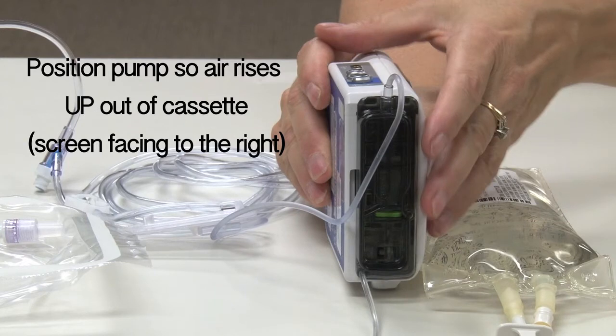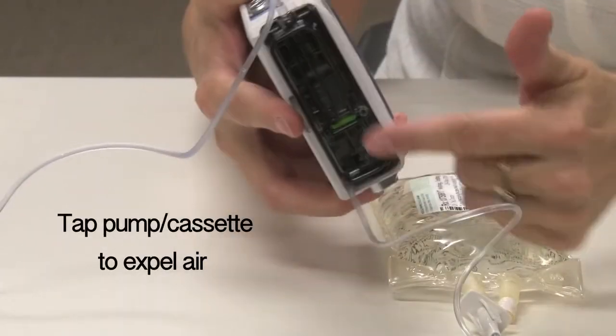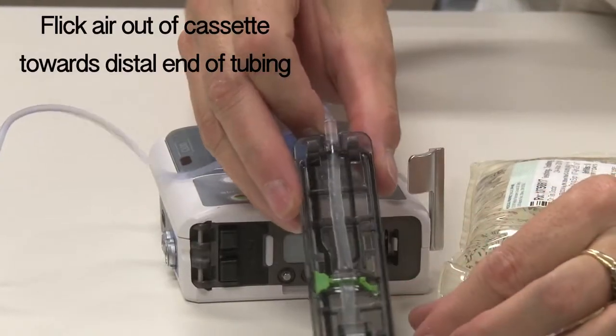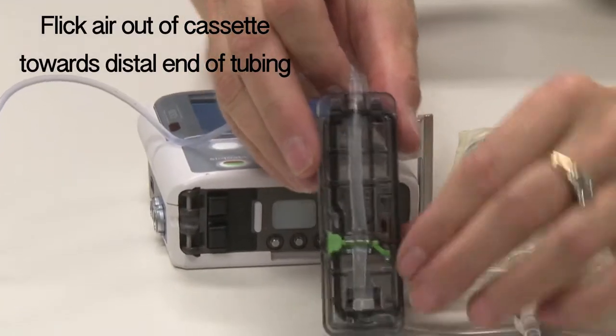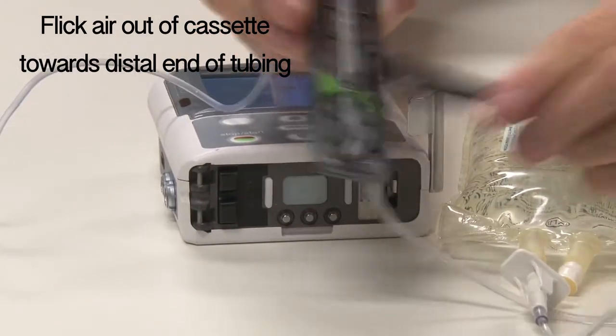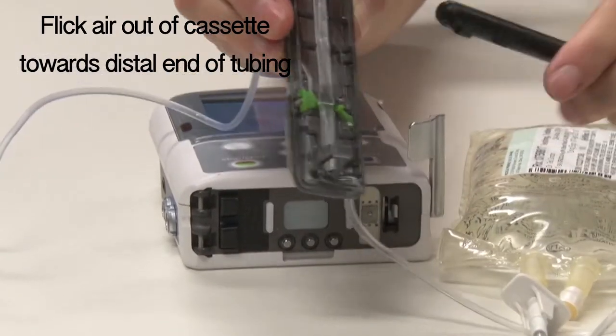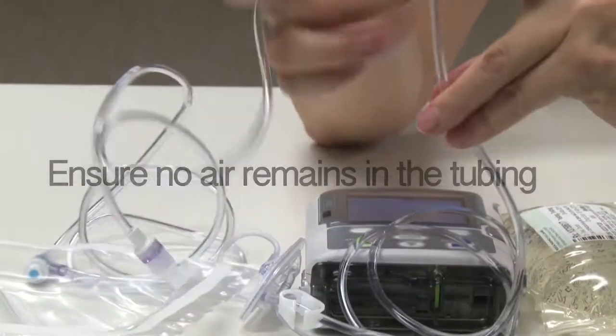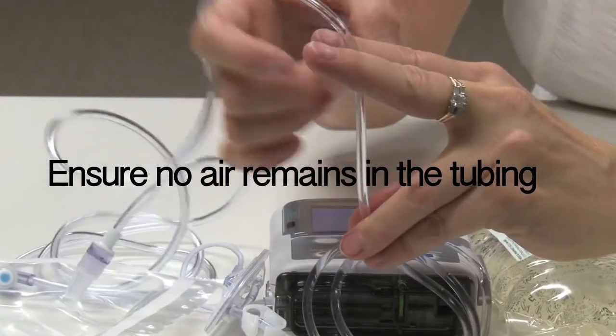This minimizes trapped air as the air rises up out of the cassette. Observe the cassette portion to see if there are any air bubbles. Flick any air out, ensuring that the pump is positioned so that the air rises up towards the end of the tubing — you do not want to position it whereby the air will rise back up towards the bag. Tap the filter and remove any air bubbles out of the tubing.